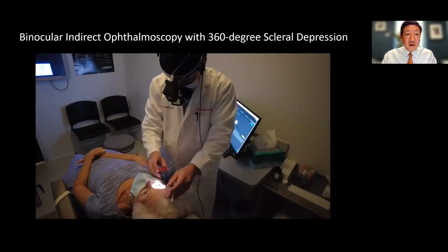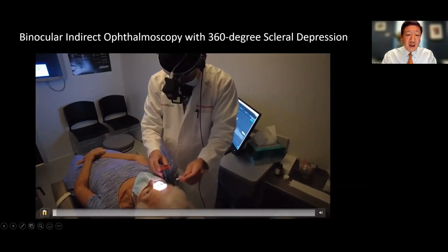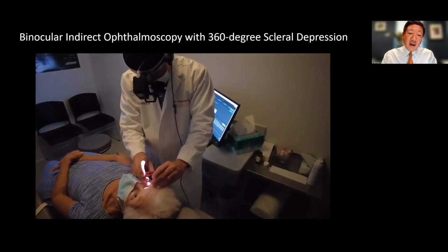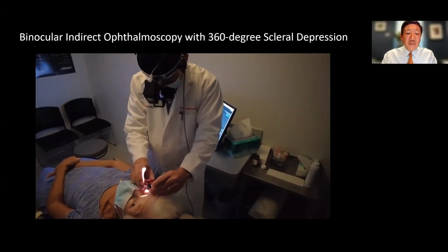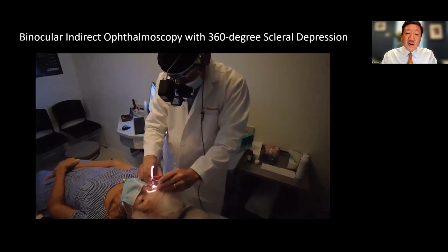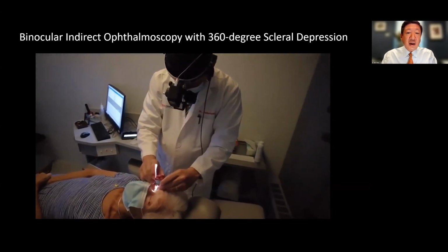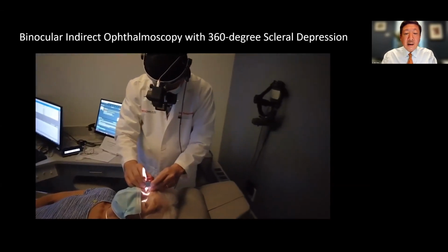Here's an example of scleral depression. You can depress directly on the surface of the eye, or you can use a cotton tip depressor, as I'm using here, on the lid. I have the patient look down, I place the depressor, and then I have the patient look up at the 12 o'clock position. And I'm describing that I see a retinal tear, and I'm encouraging the patient that she's looking in the correct direction. As you see, I'm moving in an axial pattern from 12 o'clock to 3 o'clock.